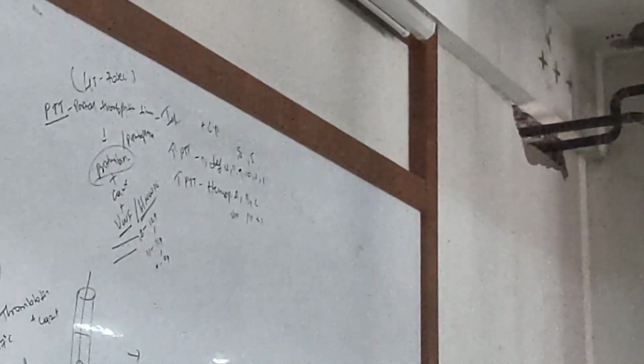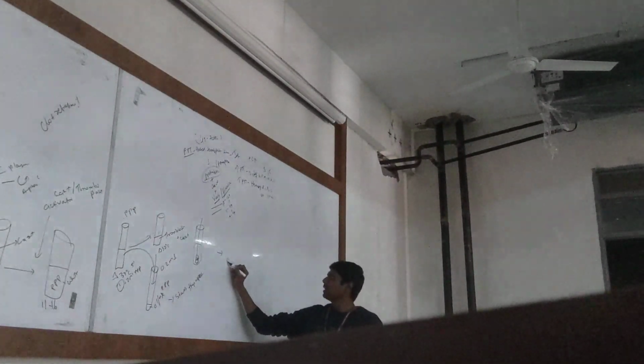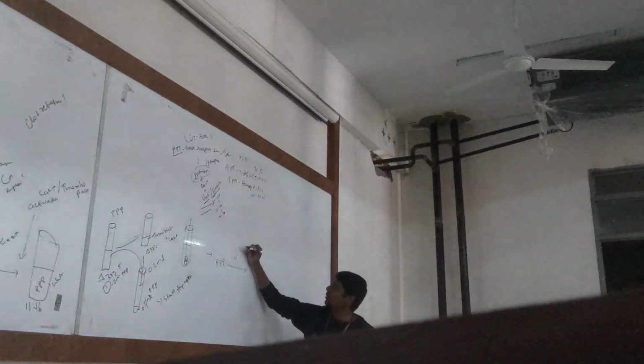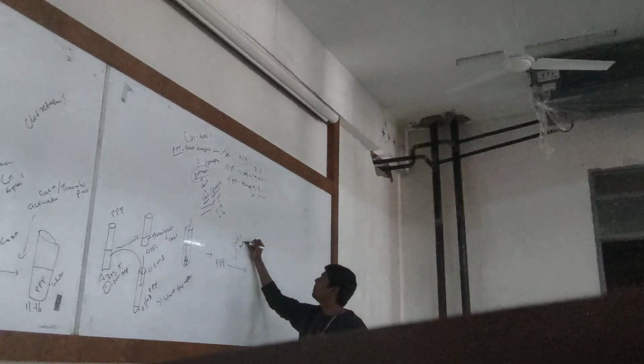Now let's go to the test. How will we do the test? In a nutshell, there is platelet poor plasma. To this platelet poor plasma, we add activators that include calcium plus partial thromboplastin.